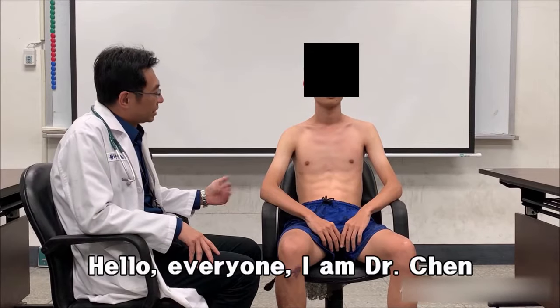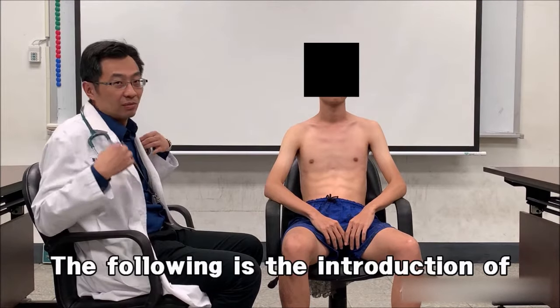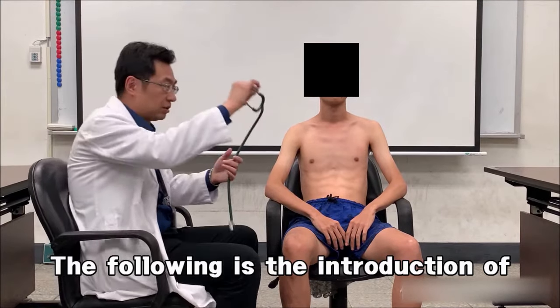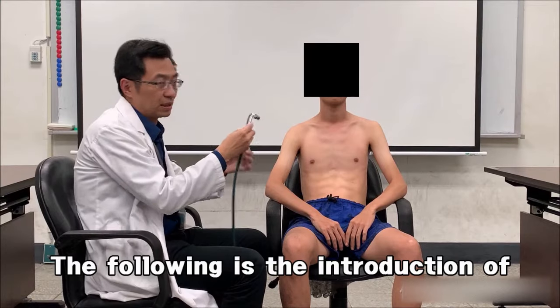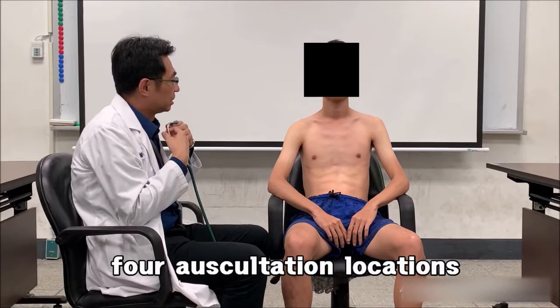Hello, everyone. I am Dr. Chen. The following is the introduction of four auscultation locations.